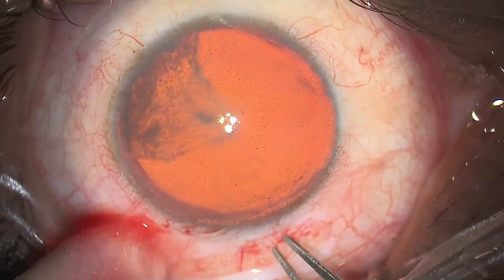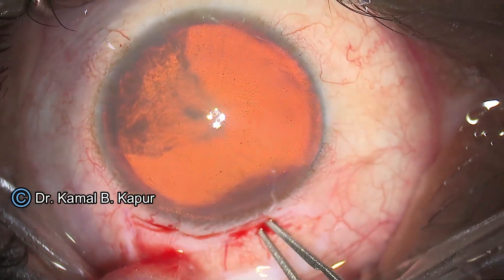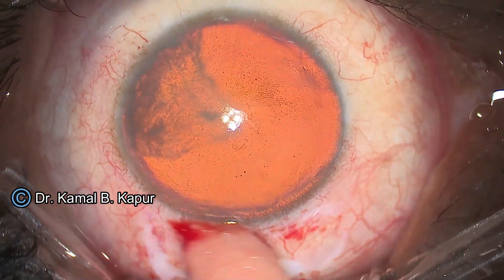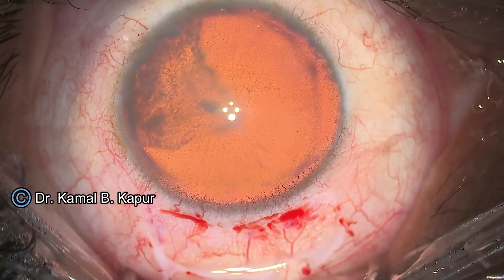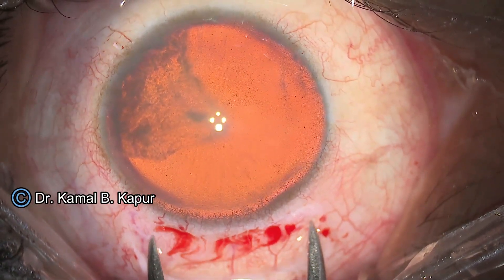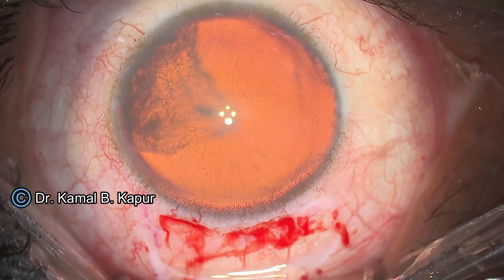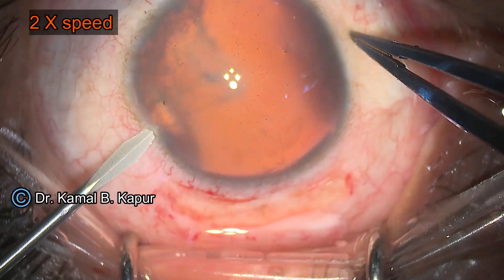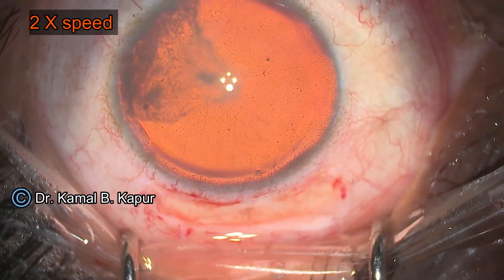These patients have a very difficult time while driving their vehicles. We start by making a scleral tunnel, and first we do a cautery. The scleral tunnel in this patient is to be made nearly as large as the diameter of the lens, so here we mark an approximate 11 millimeter length for the incision.